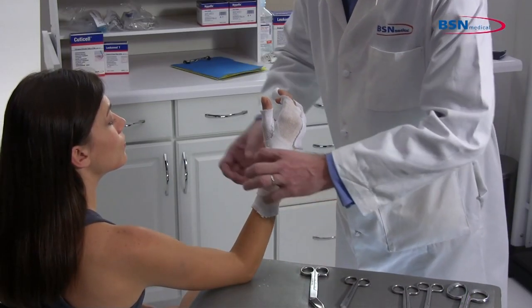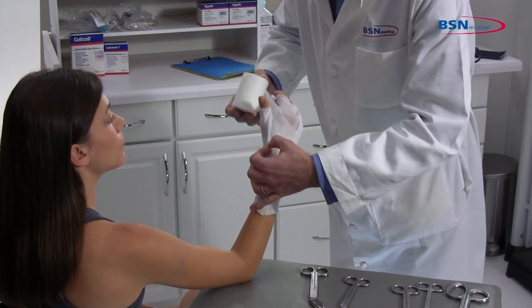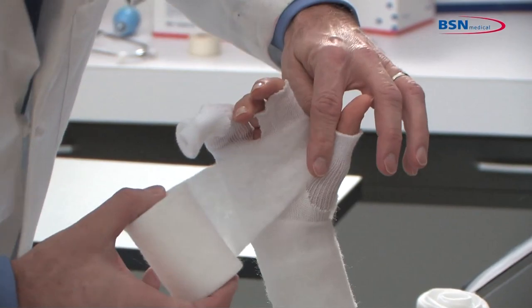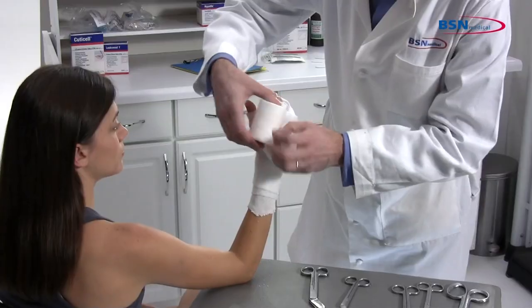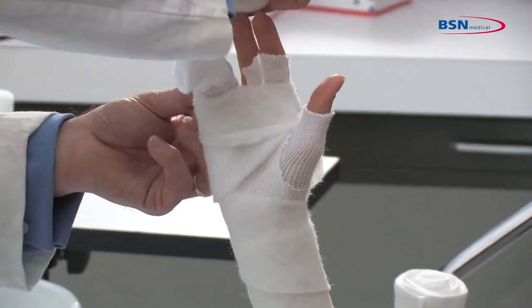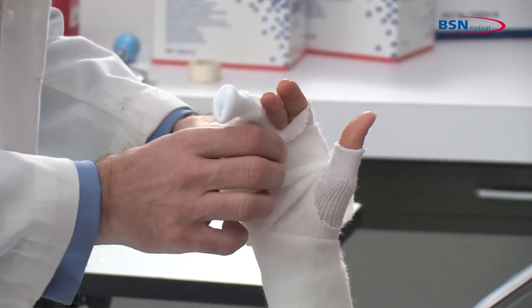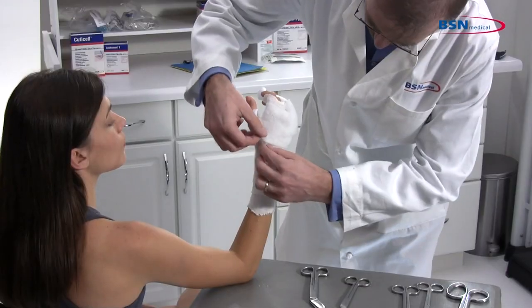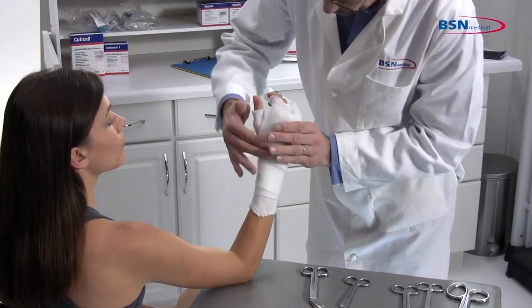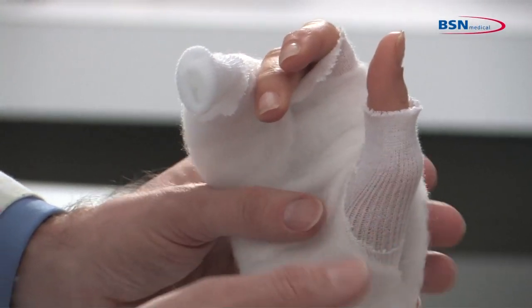Apply two-inch or three-inch padding starting below the wrist, going through the web space twice, and around the fourth and fifth phalange. Applying with a slight tension will allow the padding to lie down smoothly and have a snug fit. Additional padding may be required for bony prominences.